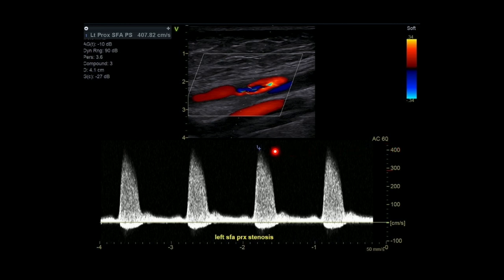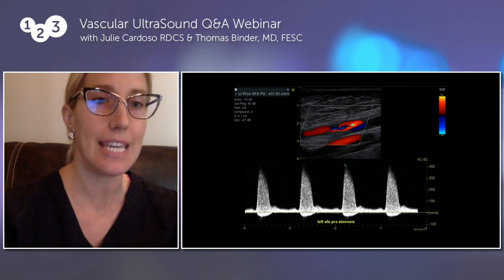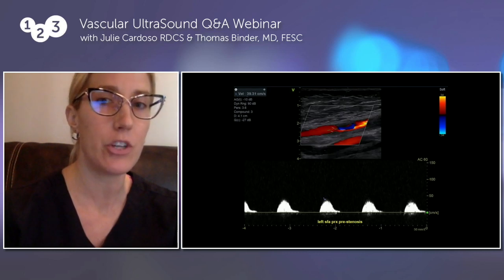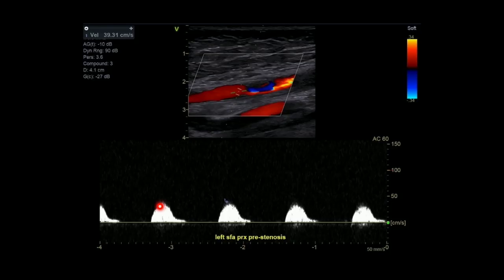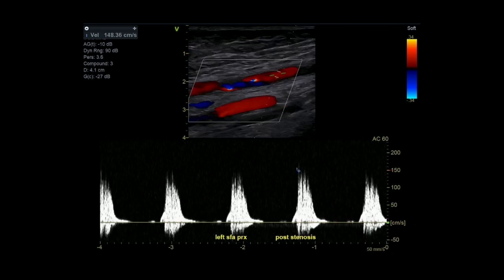In order to categorize this by the diagnostic criteria, we need to know what the ratio is. So we want to get the velocity of the blood flow right before the stenosis and see what the ratio is. If it's a 2-to-1 ratio, 3-to-1, or 4-to-1, that will categorize what the stenosis is. We can see right here that the pre-stenosis waveform is 39. So we want to see how many times 39 goes into 400, and automatically we know that this is a greater than 70% stenosis in this particular section of the superficial femoral artery.